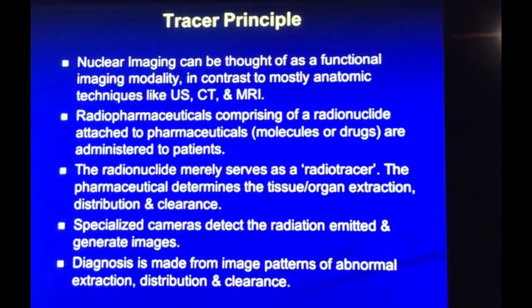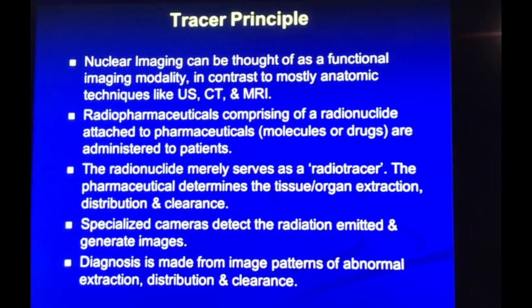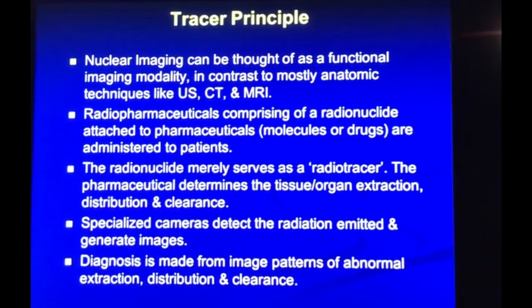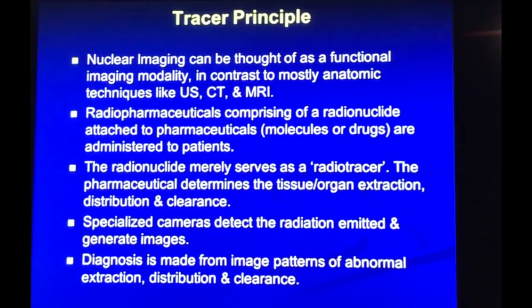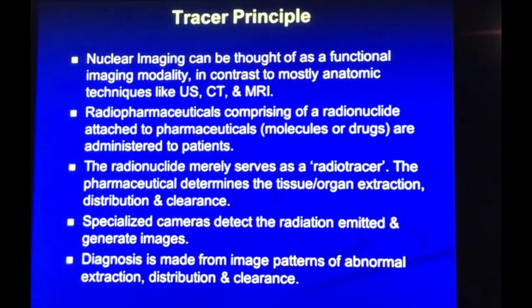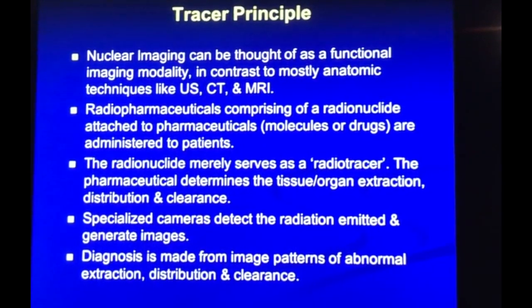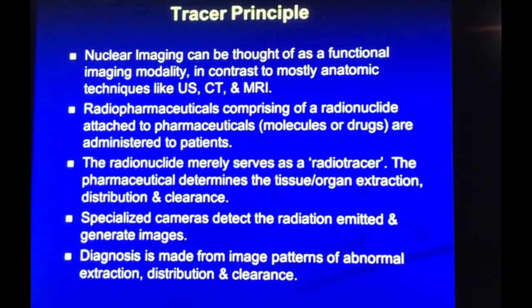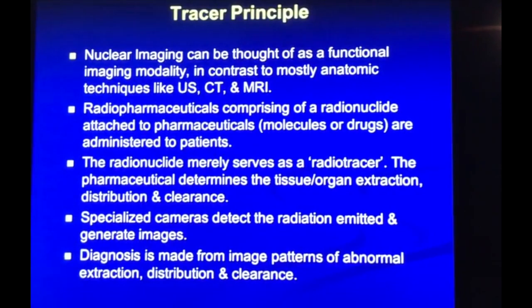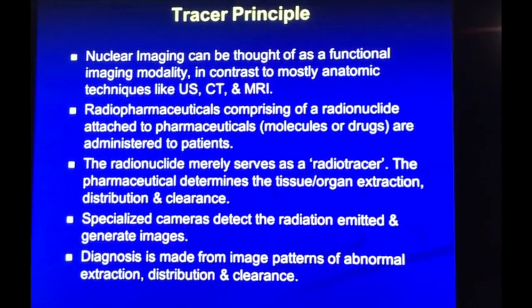At the heart of it is the radiopharmaceutical, which is a combination of a radionuclide that is attached to various types of pharmaceuticals, man-made molecules or drugs, and this combined product gets administered to patients. The radionuclide merely emits the radiation, which gets captured by the modern day gamma cameras or nuclear cameras, whereas the pharmaceutical determines the tissue or organ extraction, distribution and clearance, and thereby identifies abnormalities in those processes.